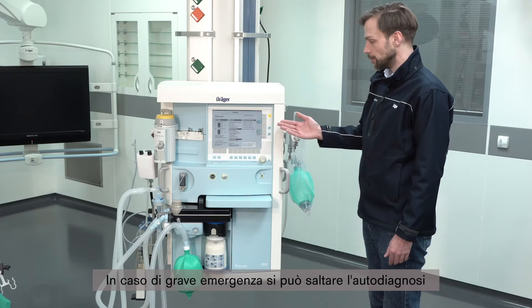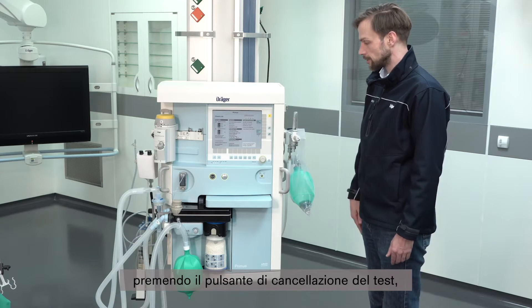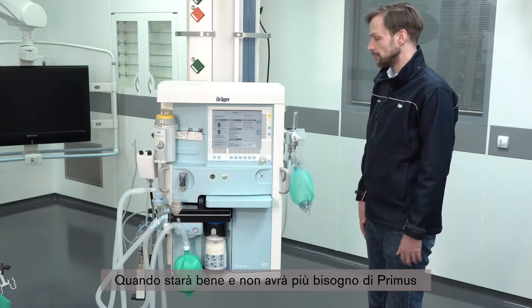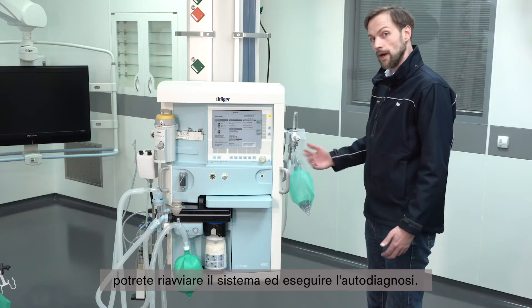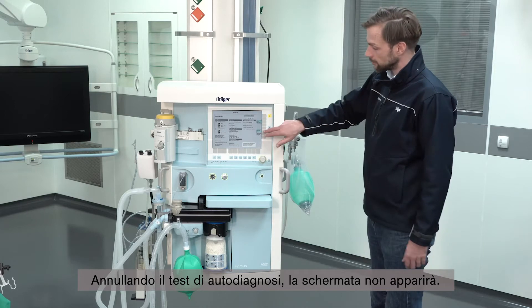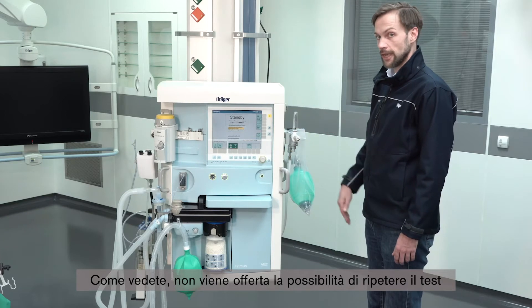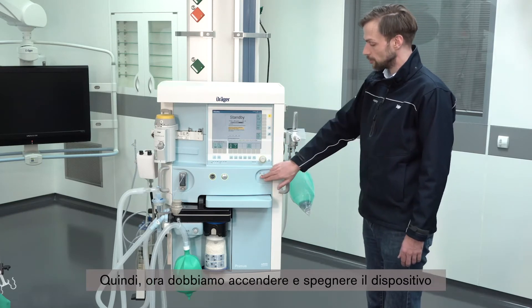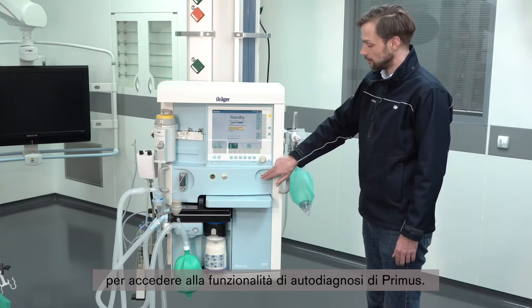In case of a real severe emergency, you can skip the self-test by pressing the cancel test procedure, so that you can serve your patient. When he is well and not in need of the Primus anymore, you can do the self-test again by rebooting the system. Note that the screen will not reappear if you cancel the self-test, so you have to turn the device on and off again to return to the self-test opportunity.